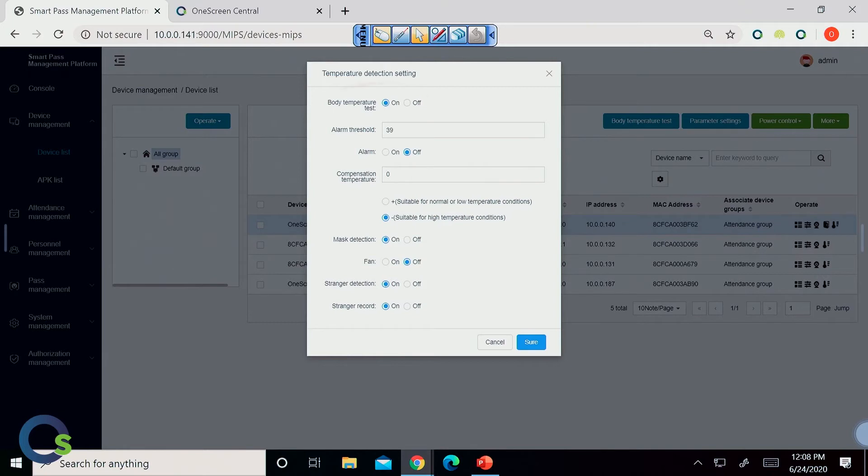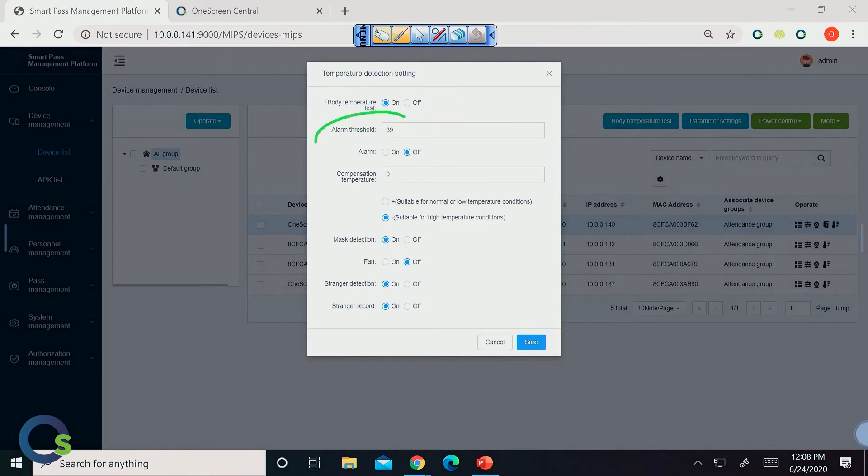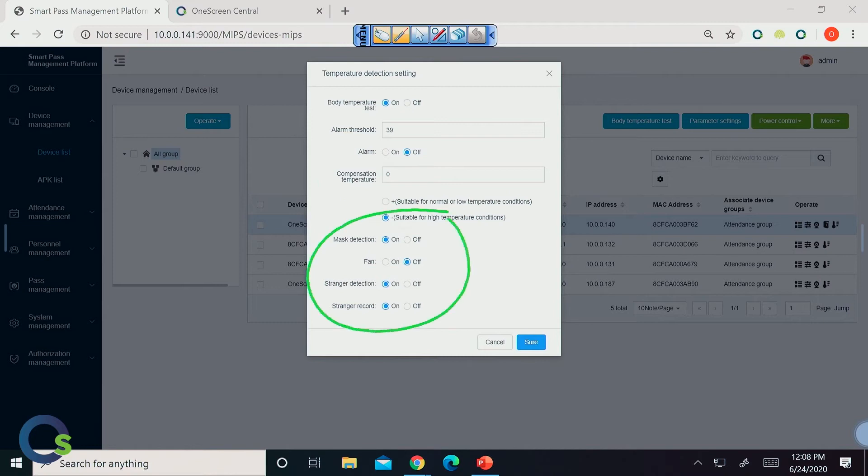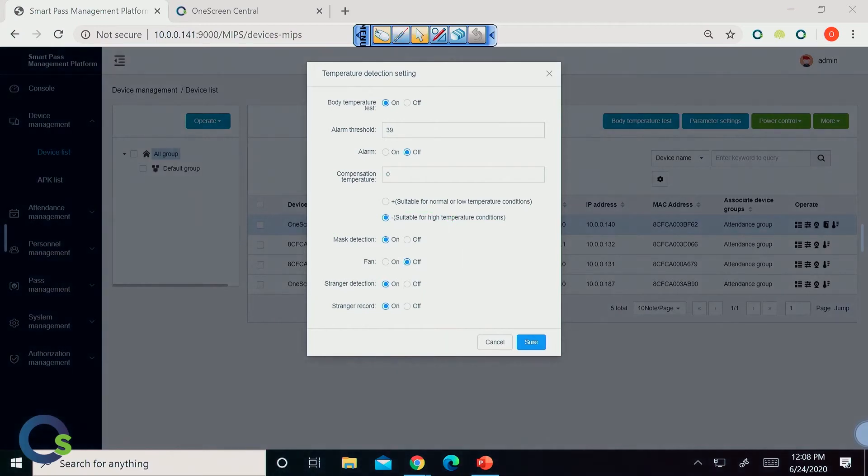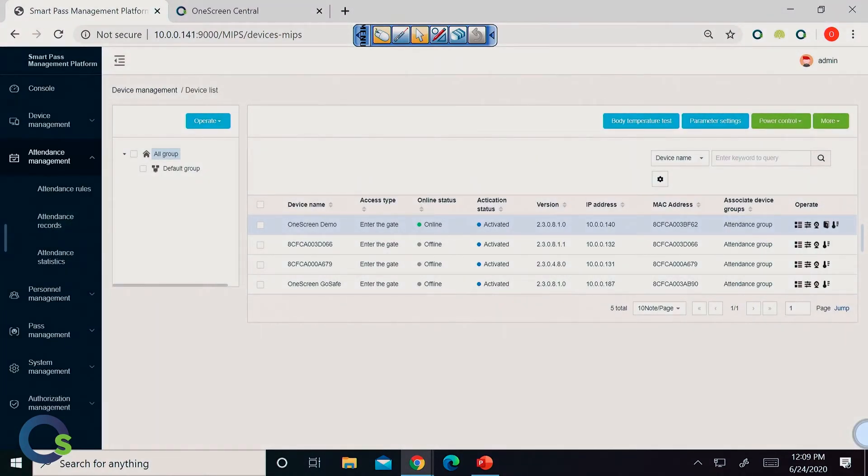So, again, we can choose whether or not we want to have the body temperature test even on or off, what the threshold is in terms of the temperature, whether there's an alarm that goes on. There's compensation for temperature, so if it's hot or cold outside to an extreme, you can also adjust for that. And down at the bottom is where all the mask detection, having a fan running, especially in higher traffic-y areas, stranger detection, stranger record, all that can be found and done right here through the management portal, which, again, is a huge reason why we do recommend to use this guy on our network application.